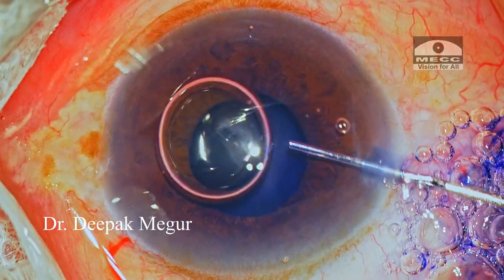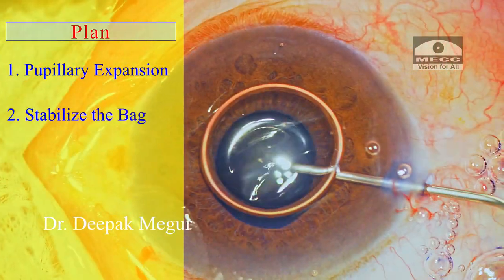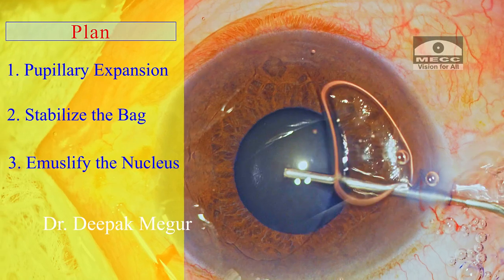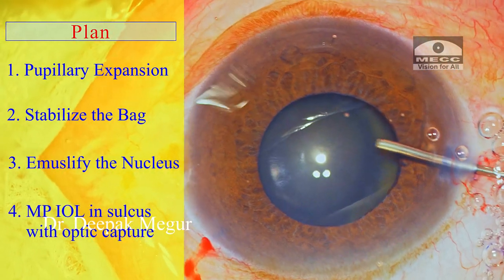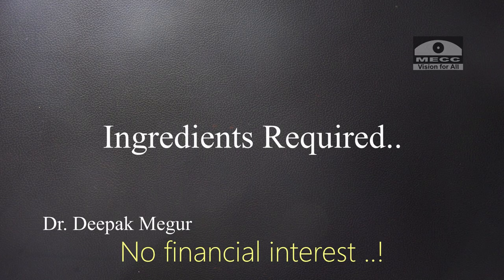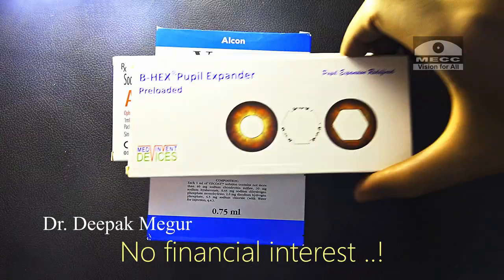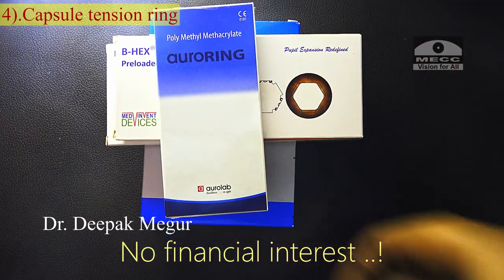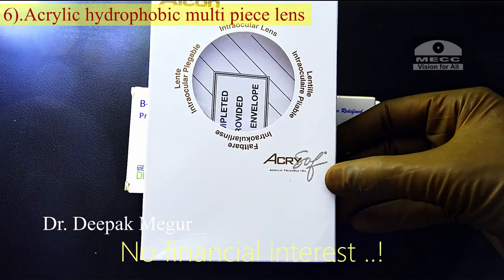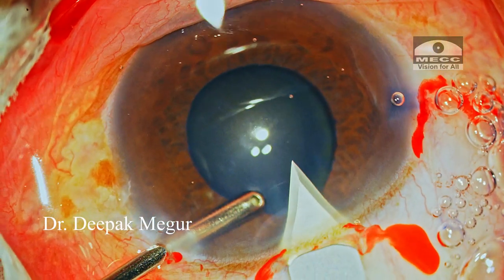My plan for this case: use a pupil expansion device to dilate the pupil, CTR to stabilize the bag, emulsify the nucleus safely, and put a multi-piece lens in the sulcus with optic capture. The ingredients I'm going to use are: dispersive OVD, cohesive OVD, B-hex ring, CTR, capsule hooks, and a multi-piece hydrophobic IOL. Capsule hooks are a standby — if need arises, I'll use them.